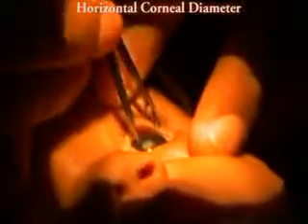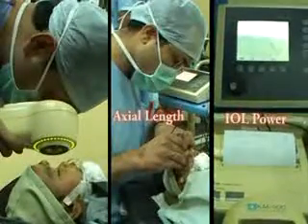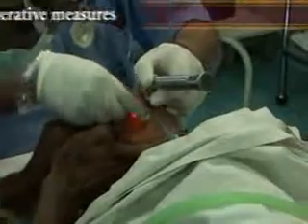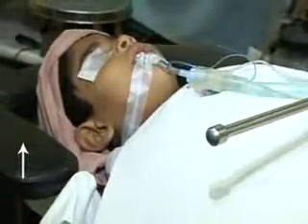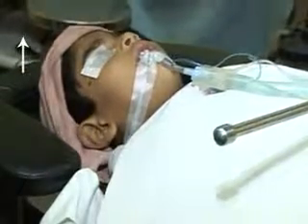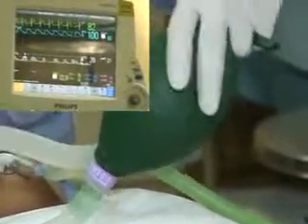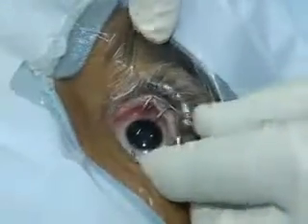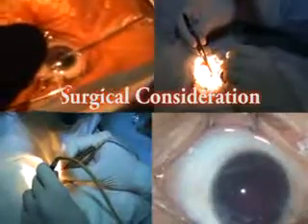Measure the horizontal corneal diameter, the axial length, and the intraocular lens power. As a safety measure, include a pediatric anesthetist in the surgical team. In preparation for the surgery, position the child with the head slightly higher to reduce positive pressure. Reduce the intraocular pressure by hyperventilation, and use a pediatric speculum to avoid pressure on the globe. Surgical consideration will be demonstrated now.